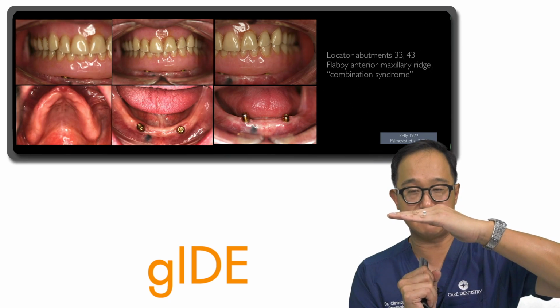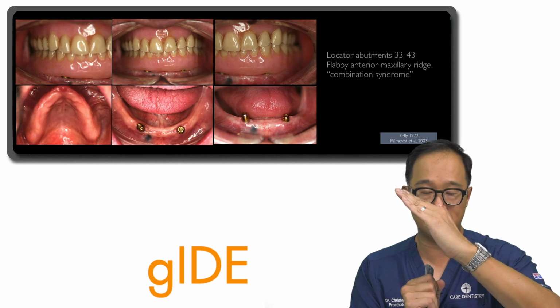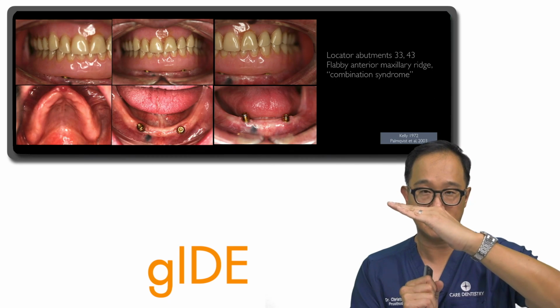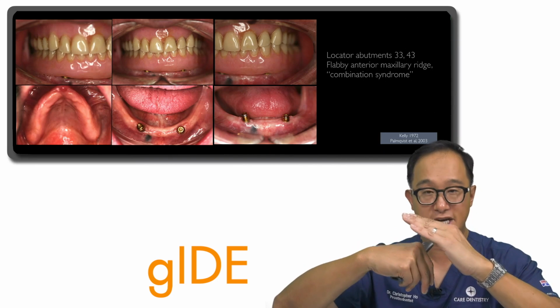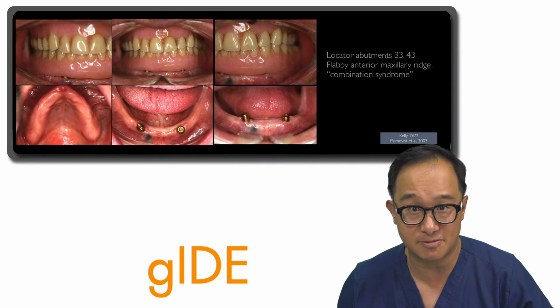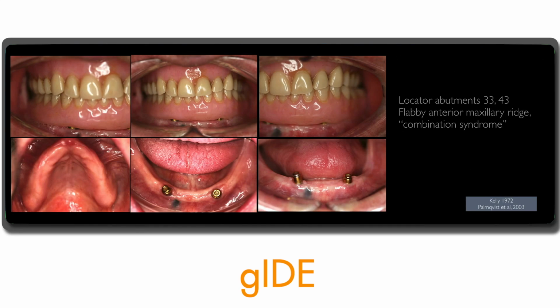As the patient masticated, the flabby anterior maxillary ridge lifted up posteriorly, and it dropped down. It allowed the prosthesis in the mandible also to rock, and it would disengage from the locator attachments. So the patient was undergoing a lot of wearing of the attachments.